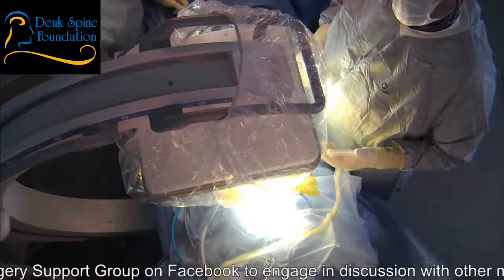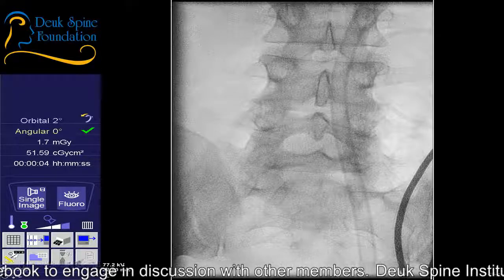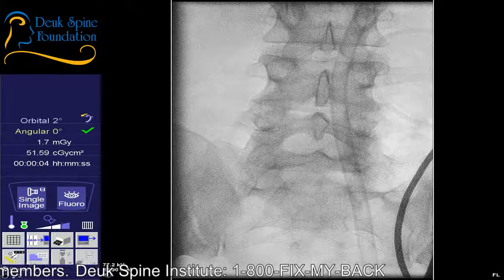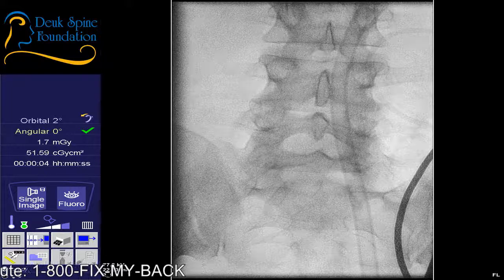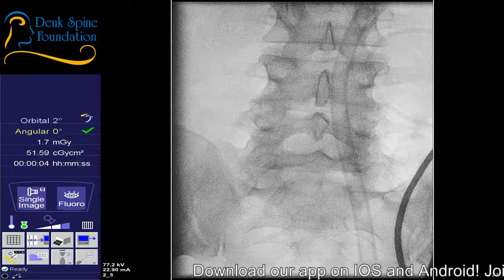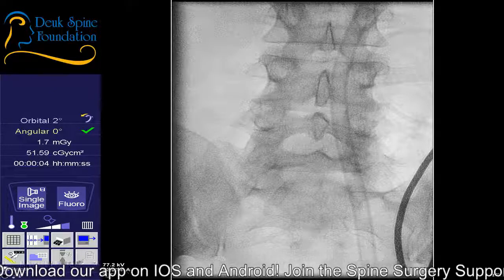Shot. I think I'm a little too low. Just try to relax. If you feel pain, just say ouch, and we'll do something about it. I've been giving you more numbing medicine to try to make it more comfortable for you. You feel anything there? How's our blood pressure? Okay, listen. I need you to pull them down. 20 points. Okay, 20 points. I always have to have one of these here, so you need to put one back here, okay? Always. Throughout the surgery. That's just me palpating around, okay?